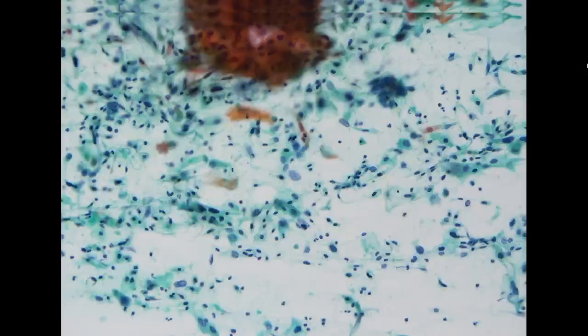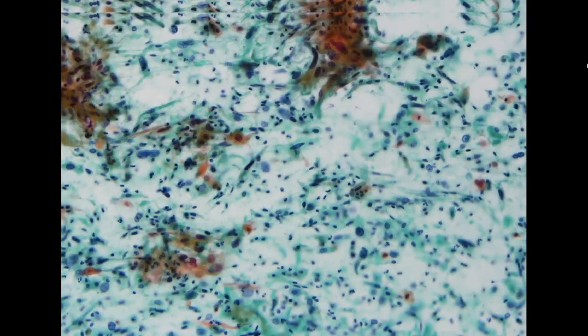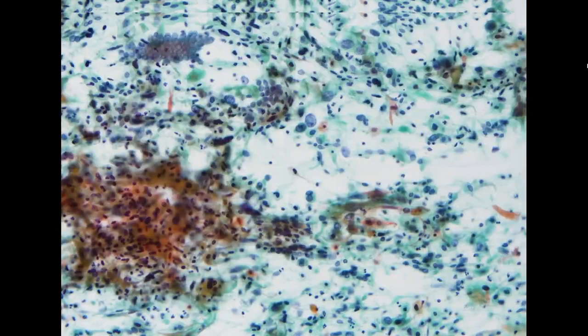Screening is very important, and in most situations nowadays where we see squamous cell carcinoma, it is in patients who never screen. And it is not because there are no resources for her. She just came to our hospital like every month, but still, she failed to join the screening program, and then it developed into an invasive cancer. Yeah, it's more lethal than the breast cancer nowadays. So this is positive for a squamous cell carcinoma.